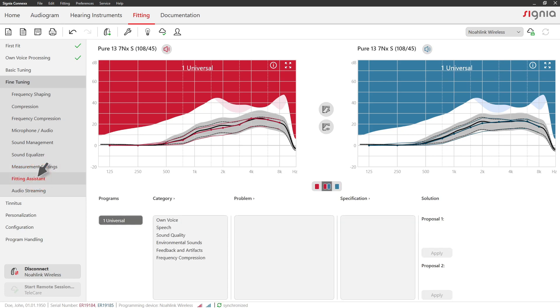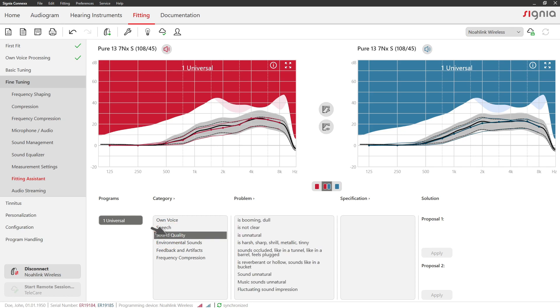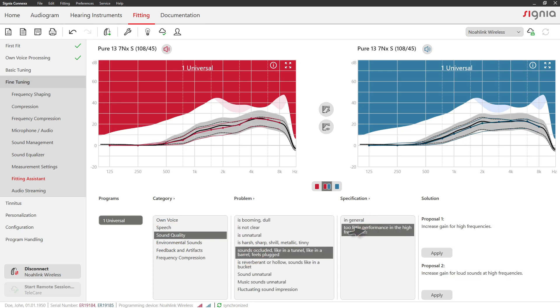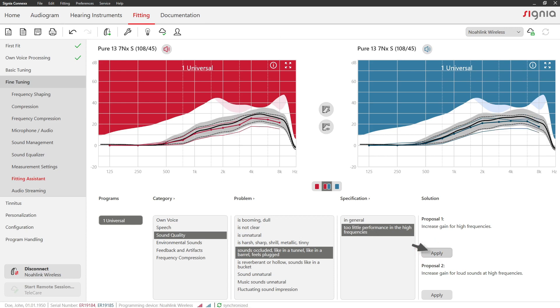The fitting assistant helps you to solve specific problems that your clients may describe. Select the problems they describe and click Apply to adjust the settings accordingly.